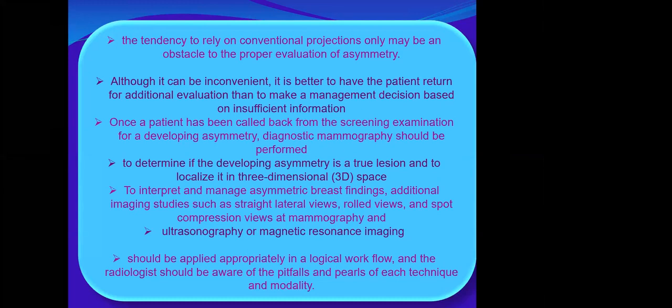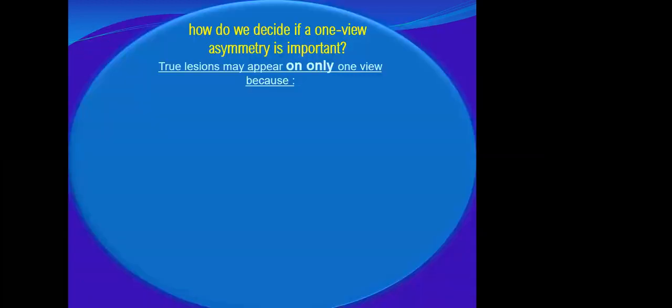We'll go through this, as well as ultrasound, tomosynthesis or magnetic resonance, you see? And we should apply them appropriately in a logical workflow, and radiologists should also be aware of the pitfalls and pearls of these techniques. We cannot put it in a fixed order, saying when you have to do this, second you have to do that. It depends on the case.